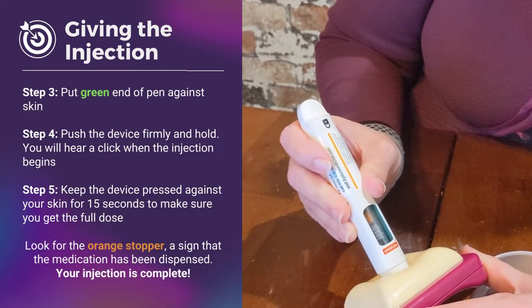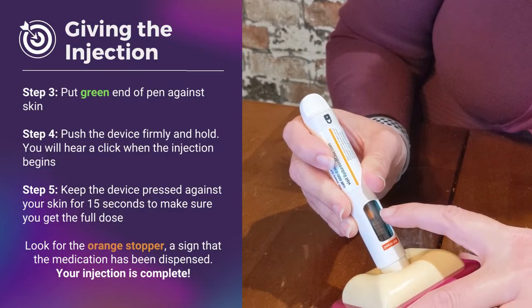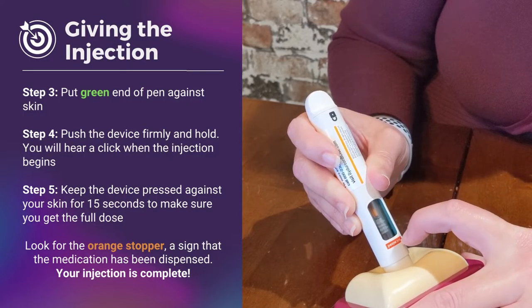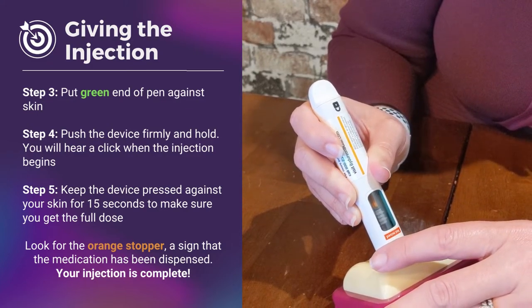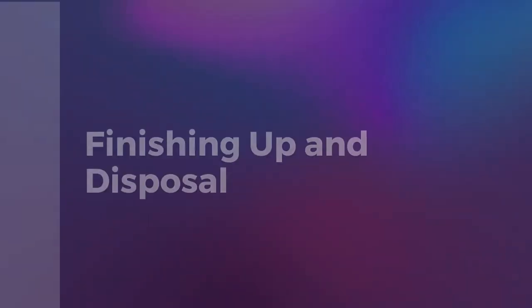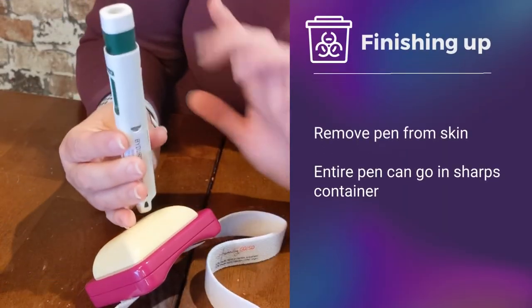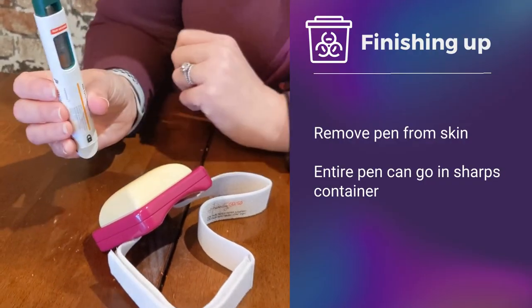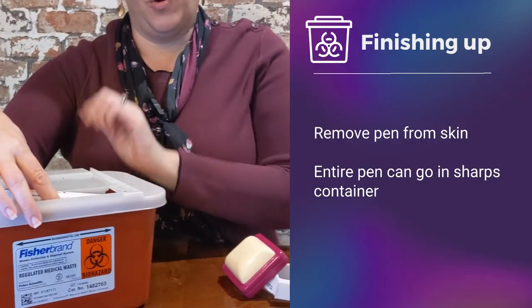Then you want to continue to hold. In this window you'll see it moving down, and once you see the orange device in there, you know that you have received the entire injection. I recommend that once you push and hear that click, you hold the pen pressed against your skin for 15 seconds. Once you're done, you simply remove. You heard that click — that demonstrates that the pen is secure. This device is then ready to go into your sharps container. Again, one time use, and you are all set.